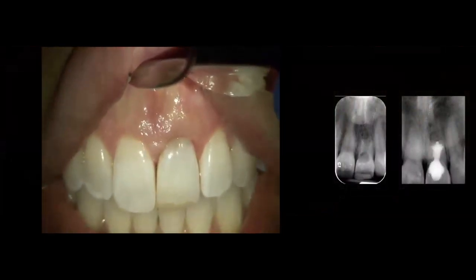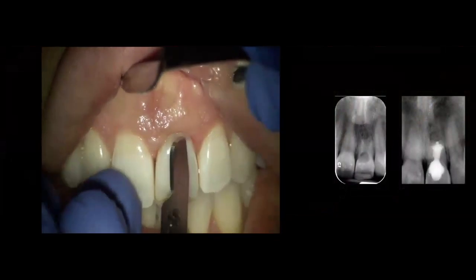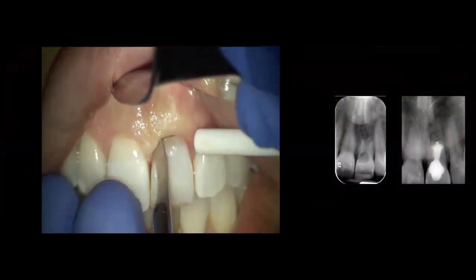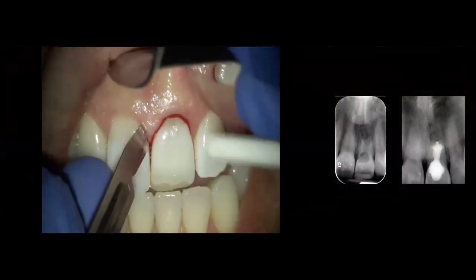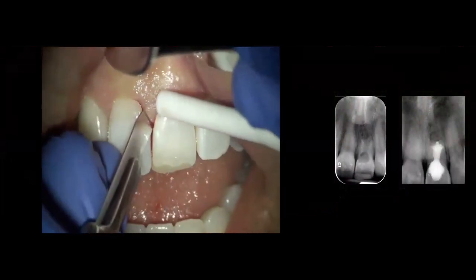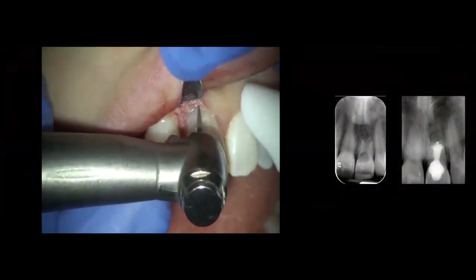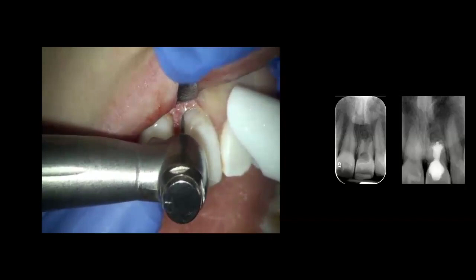You can see a little bit here of that surgery that I'm referring to, when the endodontist wanted to repair that perforation that had been done on the buccal aspect of the root surface. You can see that they're going in, they're going to do a little flap, and then they're going to access that area. They're going to fill that area with J-Restore. They're going to smooth that area nicely, and then they're going to reposition that flap exactly where it was. There you can see that they've already restored the perforation with the J-Restore. Now they're just polishing that area. All this, again, is what multidisciplinary care is all about.